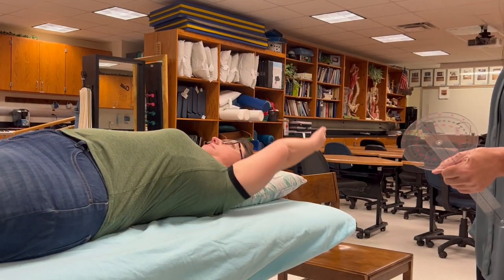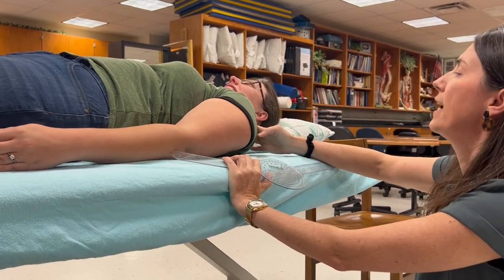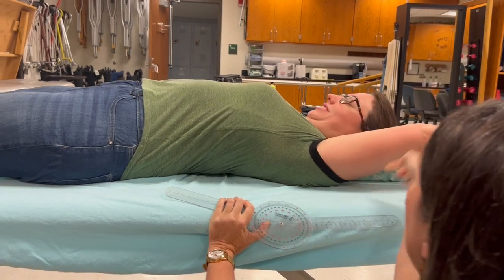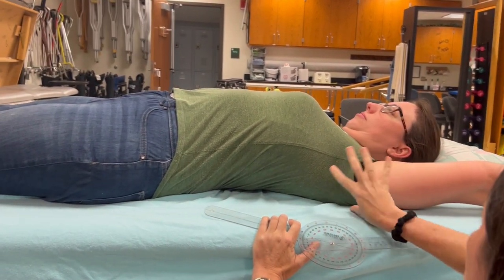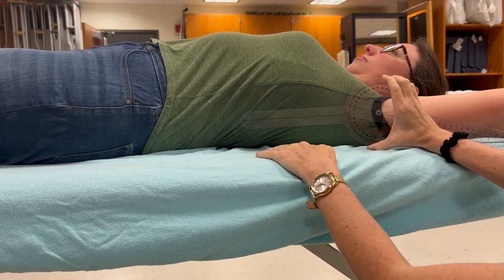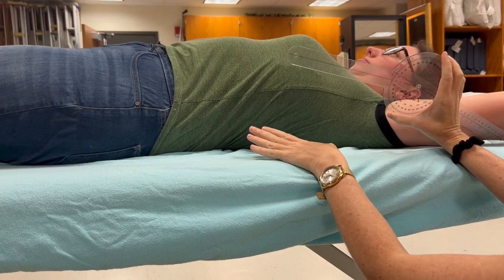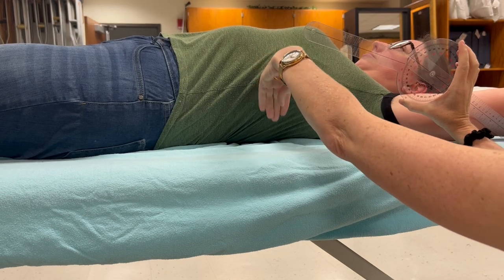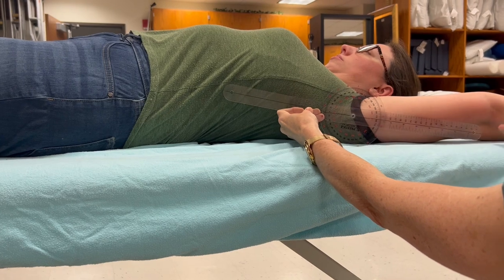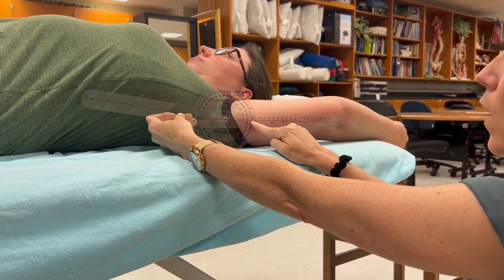Have her do that same motion again - bring your arm up overhead as far as it'll go. Technically the textbook says the acromion process is your axis of motion, however when someone flexes the acromion process disappears. So imagine where her axis of motion is happening - it's pretty much right in the armpit. The stationary arm is aligned with the lateral midline of the thorax. If there's an arch in her back, take the highest point of the arch and ignore everything distal to it. Make sure the stationary arm is parallel with that line, and the moving arm goes to the lateral epicondyle of the humerus. I'm reading 173 degrees.